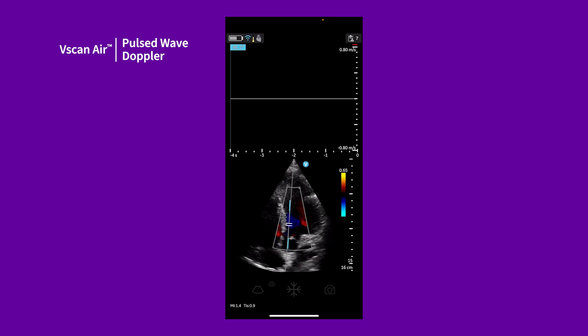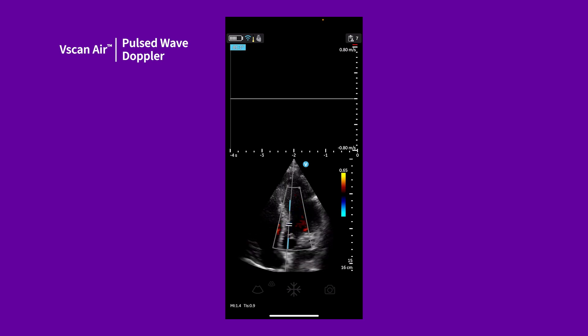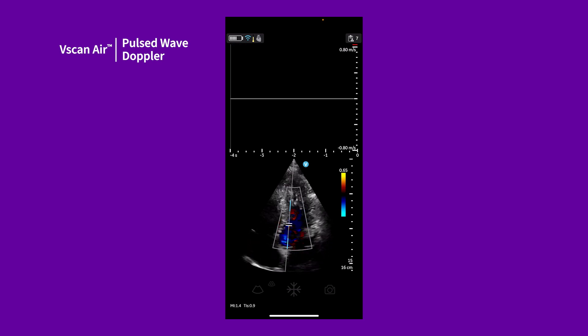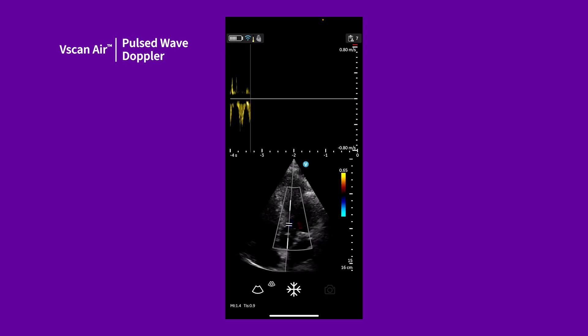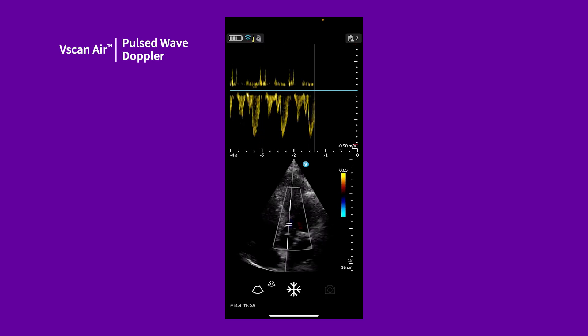Tap and hold on the image area of the screen to view the live image and adjust your view. After releasing, the PW Doppler spectrum waveform appears.